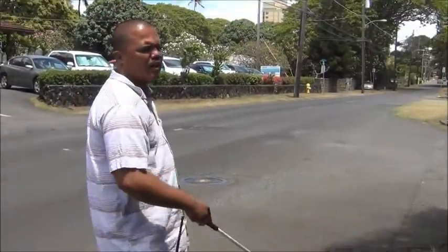So again, what I do is identify where the street is, and keep the street to my left in this instance because traffic should be on my left. I stay off of the street, of course, keeping myself on the grass. And also with gravel too, if you have gravel, you do the same thing. You walk along the gravel, find the street, make sure the street is on your left. Use the traffic as a guide, the direction that it goes, and keep it at a safe distance apart. So that's it for today.